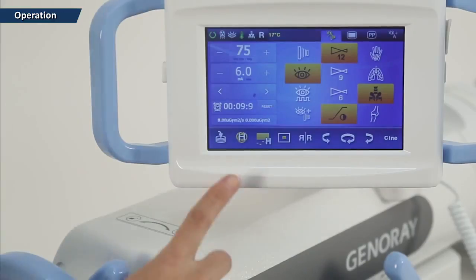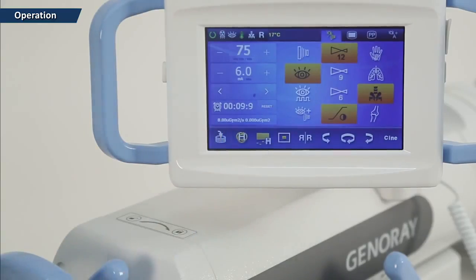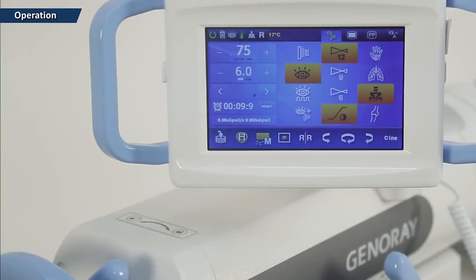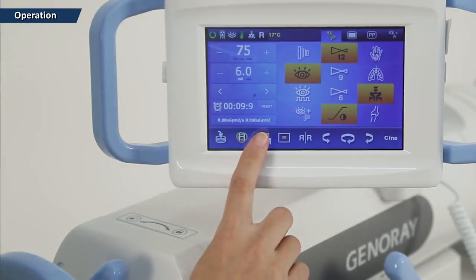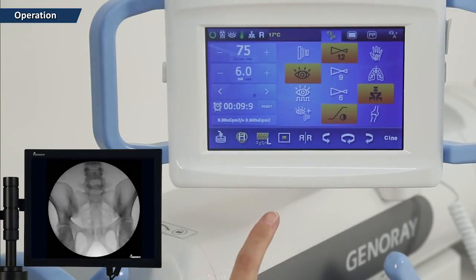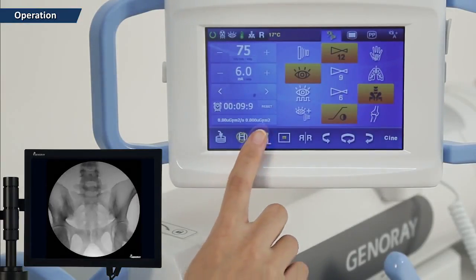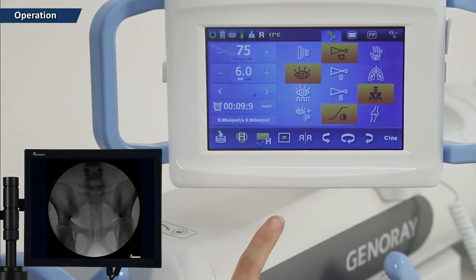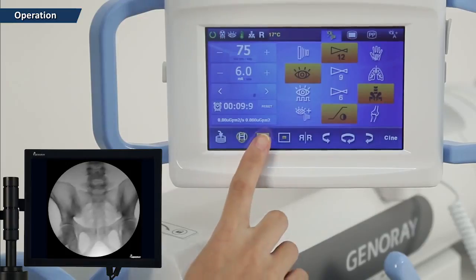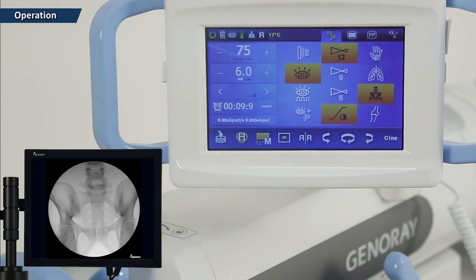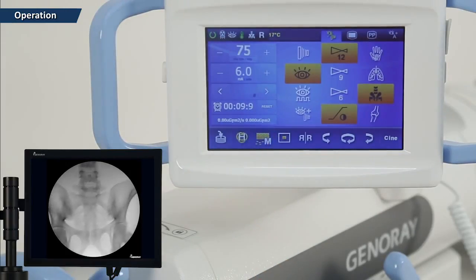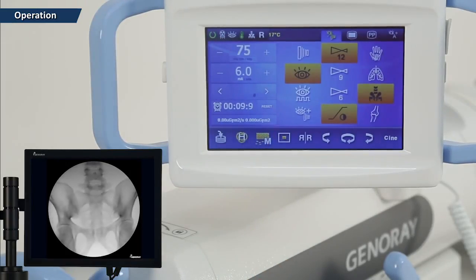Pressing the image store key saves it in the memory. The DNR key, which is to hedge against noise and after-image, is divided into low, medium, and high modes. For general use, the high auto mode and the medium DNR mode are recommended.